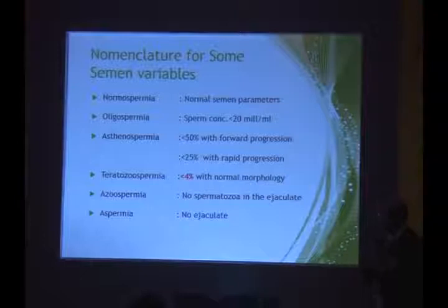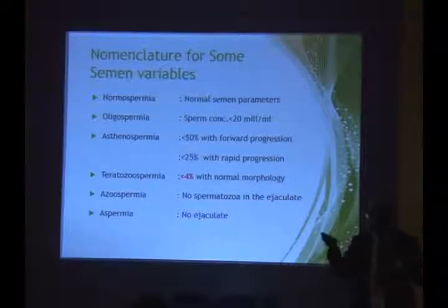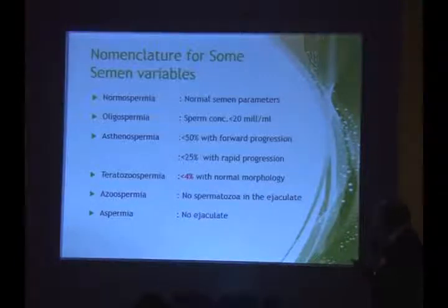Aspermia, no ejaculate. Patient fails to ejaculate, or very low volume of semen. We already discussed about it. If the semen volume is very less, which are the 4 situations in which it is very less?